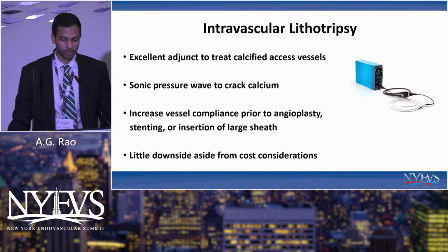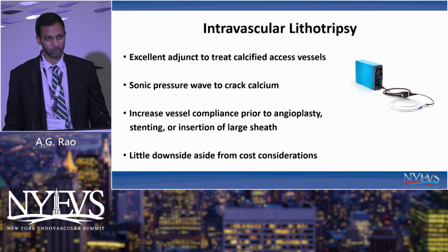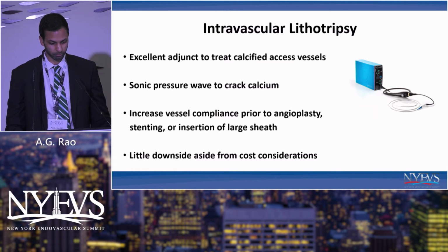The other technology that has come around, that I think we're using increasingly and that has a lot of value in small and diseased vessels, is intravascular lithotripsy. So this is an excellent adjunct to treat calcified vessels specifically. And it delivers, as we know, sonic pressure to crack the calcium to make the vessel more compliant for your large sheath. So prior to more aggressive angioplasty, stenting, or insertion of the large sheath, you can use intravascular lithotripsy to increase your compliance. And really there's, I would say, little downside from this aside from cost and a little bit more time.